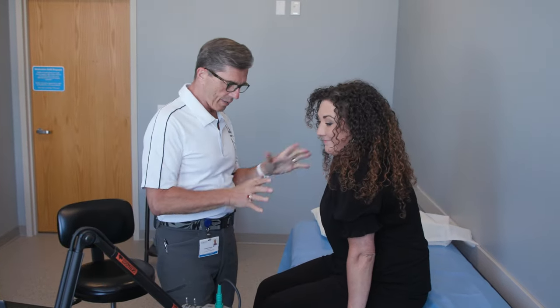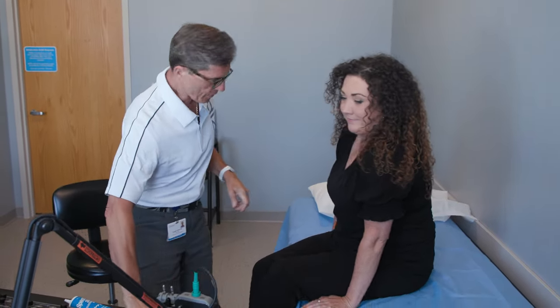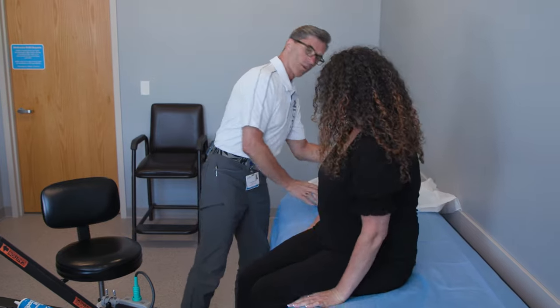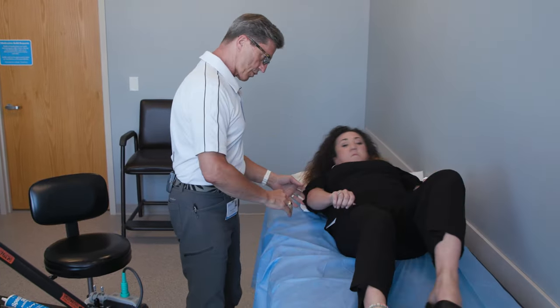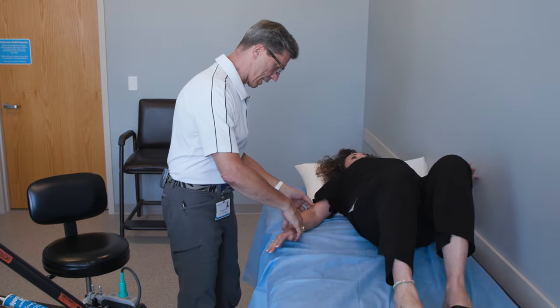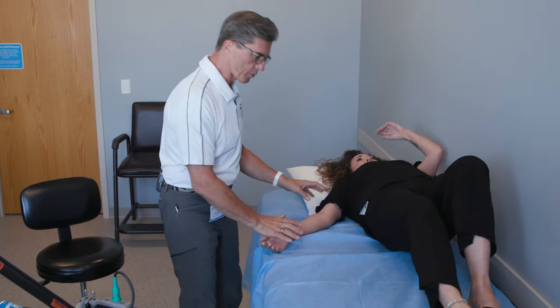Now that we've finished the exam, we're going to have you lie down for the testing itself. If you could lie down right here and get yourself comfortable, try to scoot over as far, as close to the wall as you can, just so we have room to lay your arm comfortably.